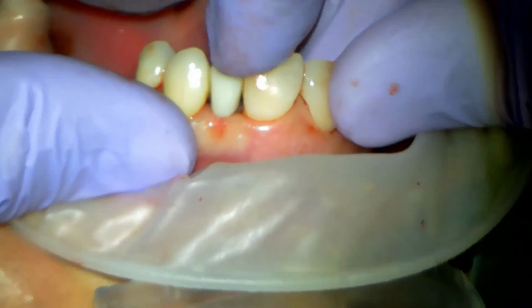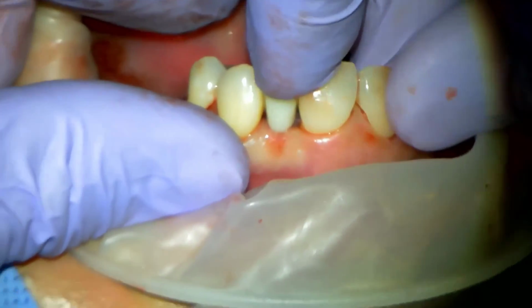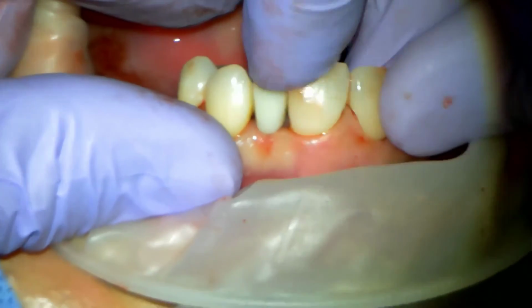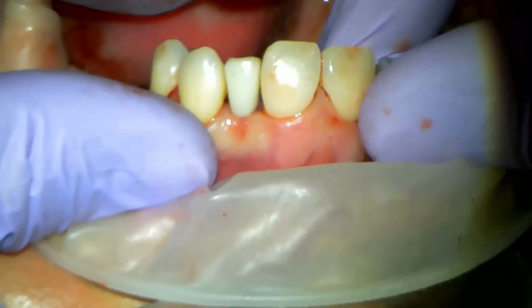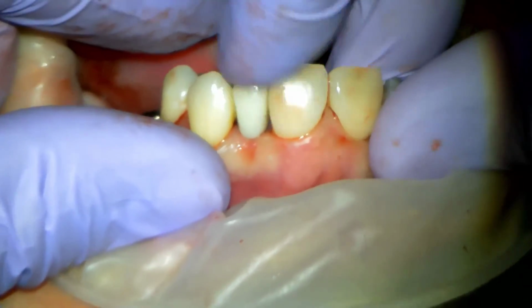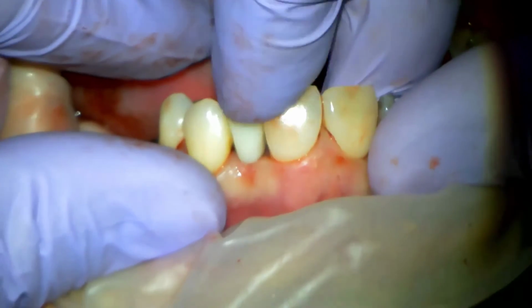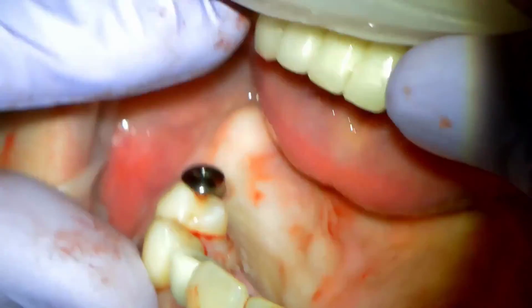There it is, pushed into position. Again, the shade was decent. Not a perfect match, but that is darn well a perfect solution for the patient. They came in with no tooth and a flipper, and they get to leave with that. We get to get the flipper out of there. She's going to love that. So that looks fantastic. We're going to let that set up.